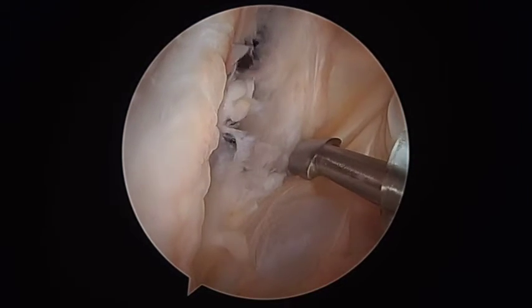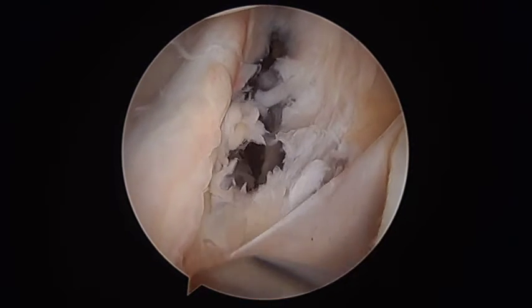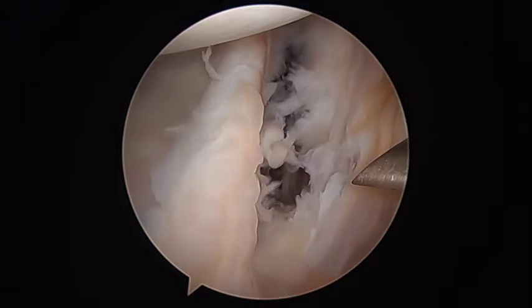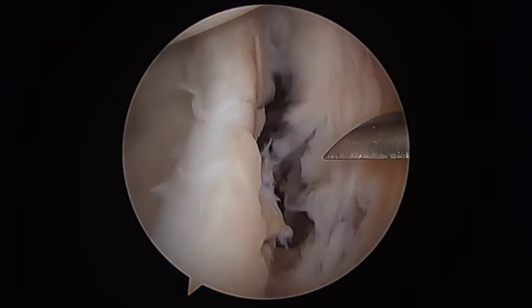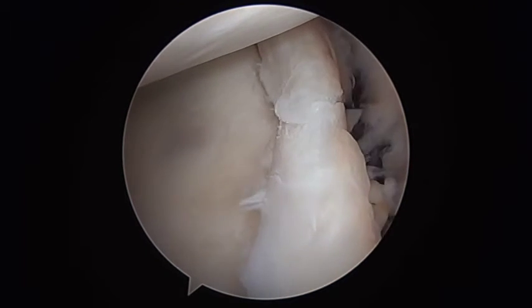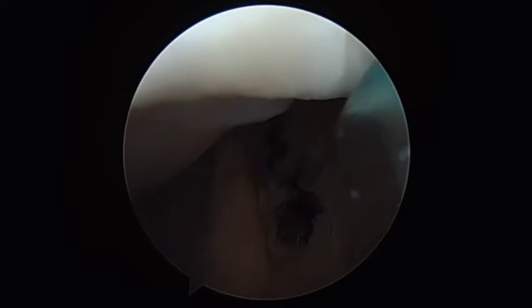The posterior labrum was found to be intact. Additionally, the anterior-inferior and posterior-inferior capsular structures were well attached down to the humerus. Importantly, we note from this that there's both a Bankart tear as well as a capsular split. Therefore, the capsule is torn and needs to be addressed in addition to the labrum.